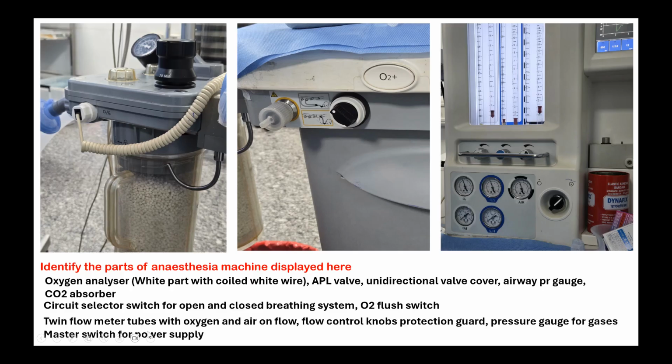Okay, so this is a twin flow meter tube with oxygen and air on flow. So the first and third are open. Both the oxygen and air are on, and the flow control knobs, protection guard, pressure gauges for gases, and master switch for power supply are all seen here.